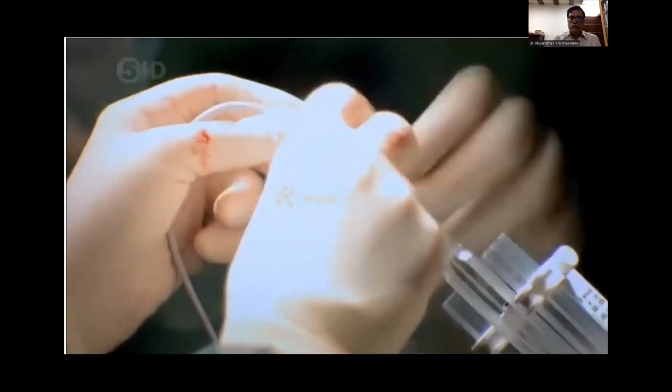The team send different currents through the electrode to test what voltage is going to best control Mark's tremor. Open close as fast as they can. Take your index finger and touch your fingers back as fast as you can.